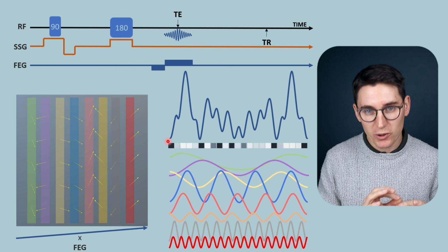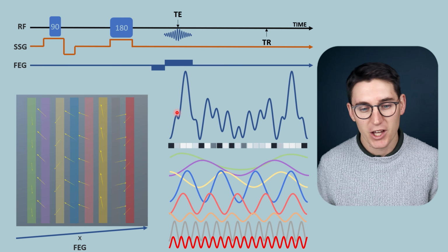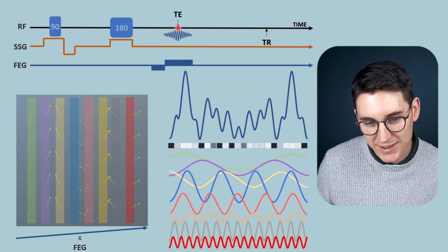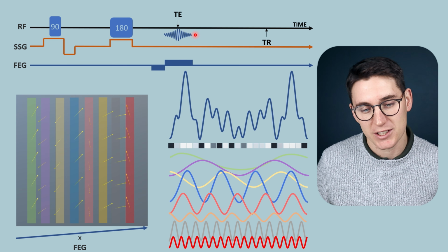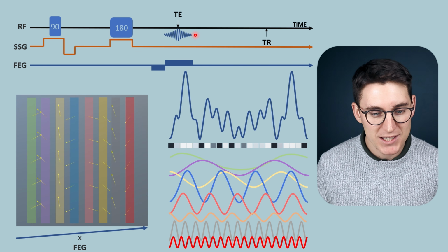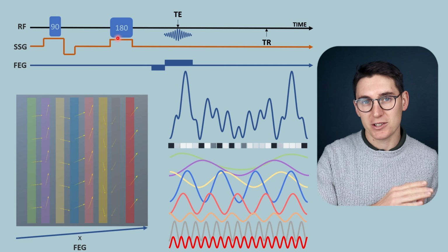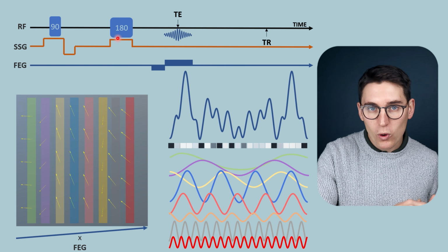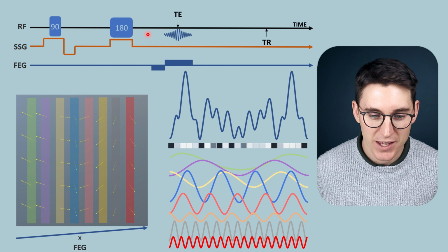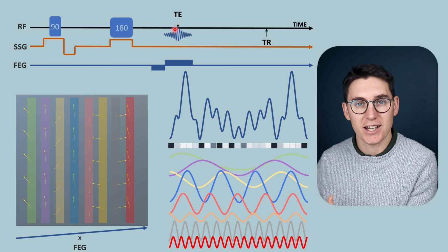Now, in the previous talk, in order to avoid some confusion, I used this example here, which is technically incorrect. You can see that when we are acquiring the signal, we get this rephasing and then dephasing at a free induction decay rate of the signal. Now, what causes that rephasing and dephasing at TE? Well, it's this 180-degree radio frequency pulse. That 180-degree radio frequency pulse, as we looked at in the slice selection talk, causes the spins to dephase and then rephase exactly at TE. And we get that rephasing causing an increase in signal, and then we get that free induction decay.